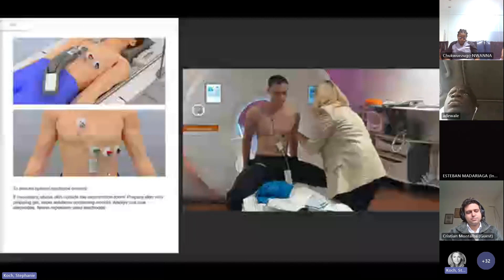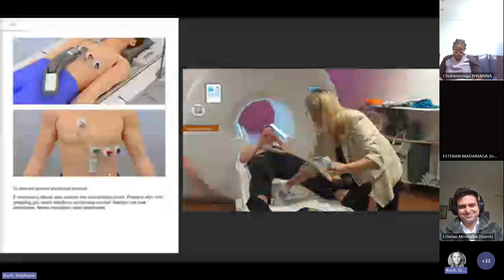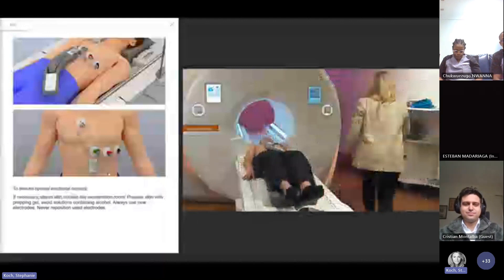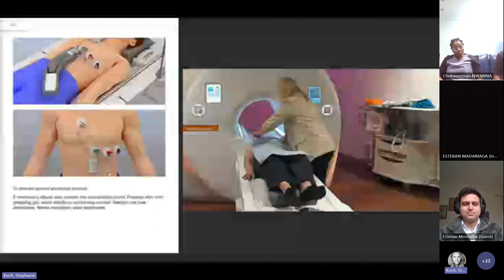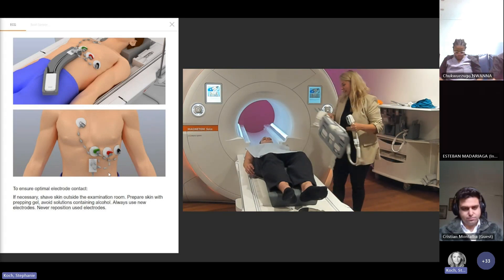Then we have a nice positioning tool here, our ECG banana. You can lay down shortly. We can position this precisely and then remove all the stuff. I give them some comfort parts as well. What I do now is make a small curve over it so it doesn't get too cold. This is the preparation for the ECG part.